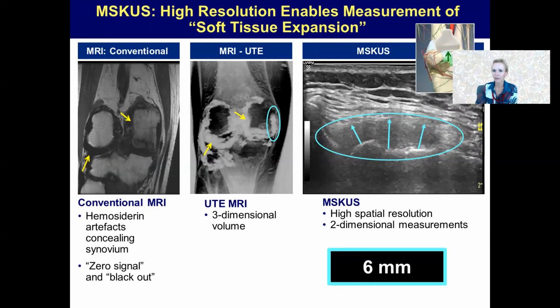And that's the advantage of a protocol like the JADE protocol, because it uses the spatial resolution to really place precise measurements. And then within those measurements or within different treatments, you might follow the resolution of the synovial hypertrophy, which even if just resolving by 3 millimeters might still on a scoring protocol have a very high score, hit a ceiling and not being captured.